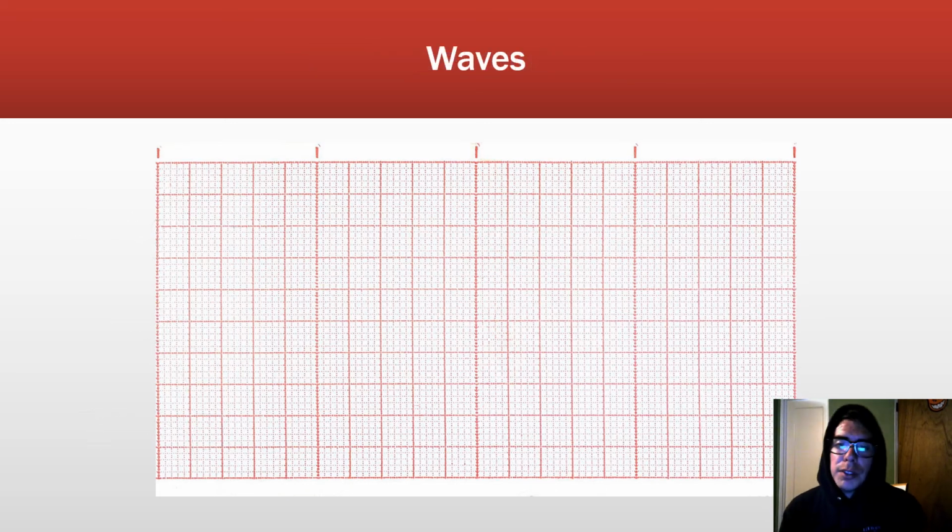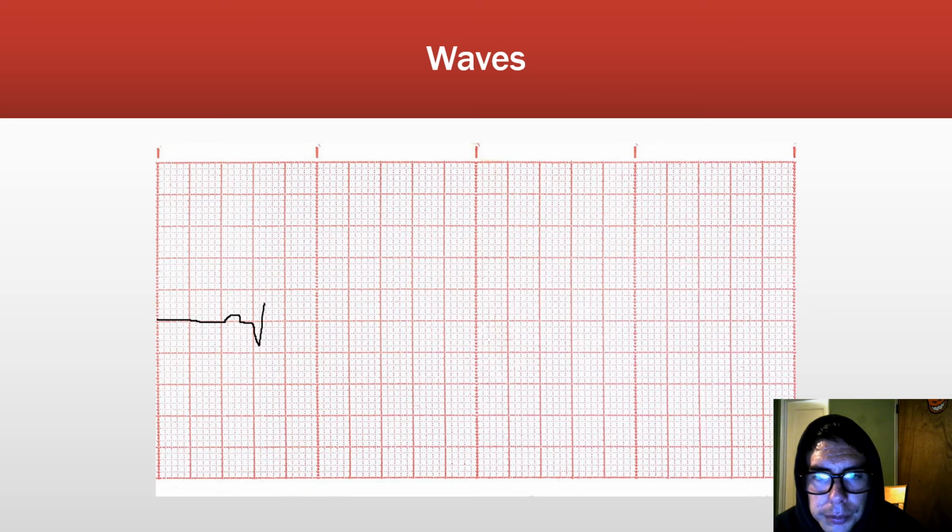So now we're going to talk about the waves of a normal heart rhythm. So we have, oh my gosh, like that. And that was a terrible drawing.